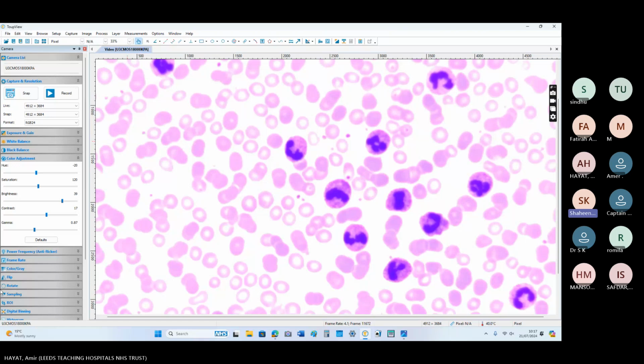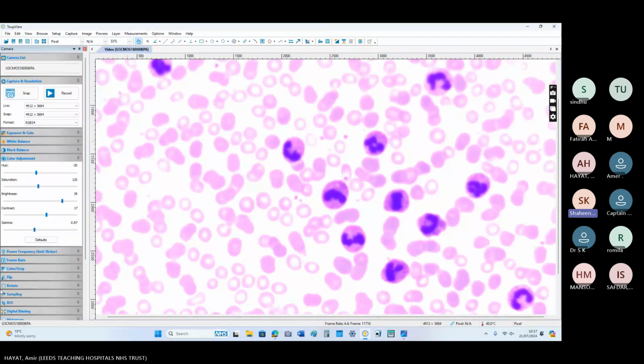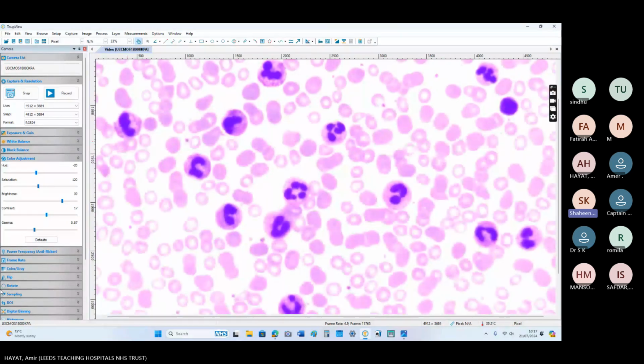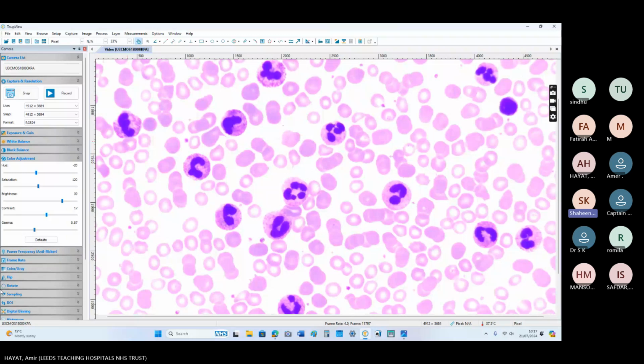Yeah, it could be a possibility, but as the patient is clinically correlating with reactive neutrophil leukocytosis, right now I will observe the count, let the patient stabilize or improve, and then if it's a persistent count with basophilia, I can go for CML if it's persistently high. Don't say it like that in the exam, that it is a possibility. That is not okay.